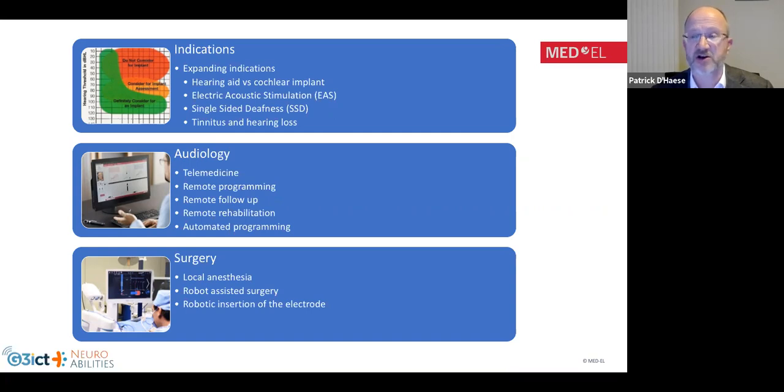Applications such as a cochlear implant in the case of single-sided deafness, unilateral deafness, are already happening in research projects. And also clearly a lot of research centers are looking into whether you can suppress tinnitus with electrical stimulation provided by a cochlear implant. Now, the last two domains I want to tackle are audiology and surgery.